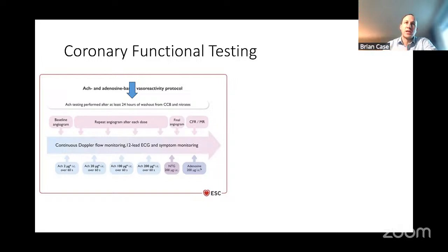For my patients, I try to avoid a radial cocktail, and if I'm going to give something, I'll give nitroglycerin. This is important. A lot of CMD coronary functional testing programs will do all of their cases femoral, just to avoid dealing with the spasm that patients sometimes experience going radially, especially because 2/3 of your patients are going to be women, and there's a higher incidence of spasm in women. So some centers just say, for our coronary functional testing, we're going to go femoral. At MedStar, we still go radial, and we just try to avoid giving the radial cocktail so we get a good study.